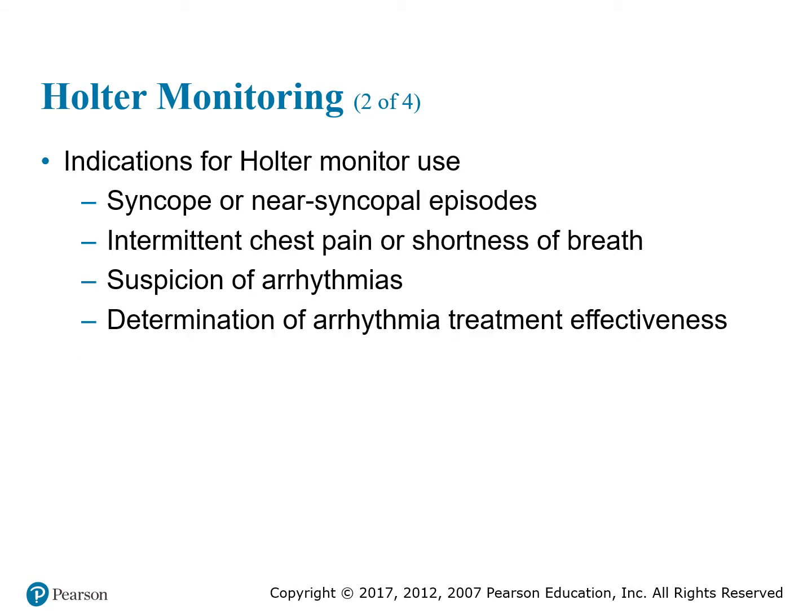The Holter monitor is an ambulatory EKG device used to rule out intermittent arrhythmias or cardiac ischemia that might be missed on a routine EKG. As a healthcare professional, you may be responsible for applying and removing the Holter monitor, providing patient education, and ensuring that the results are placed in the patient's chart. You may have to upload the data into a computer so that the computer may analyze the information.